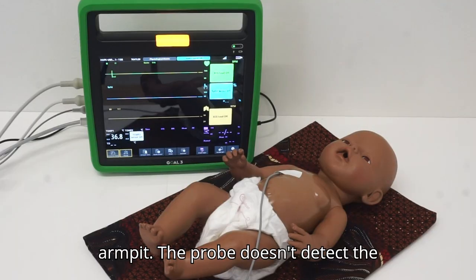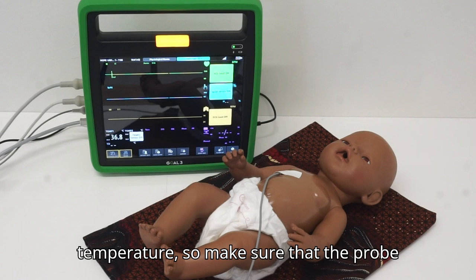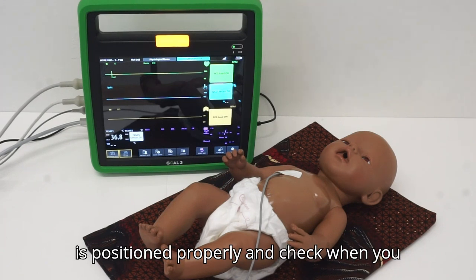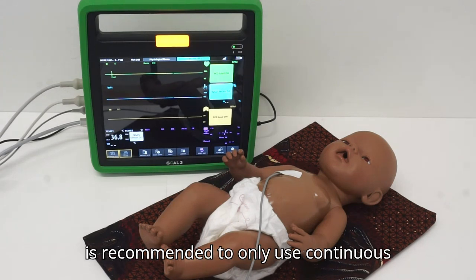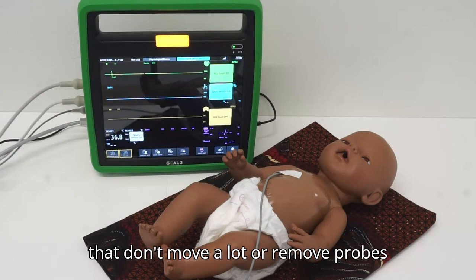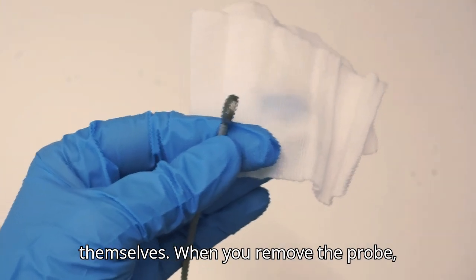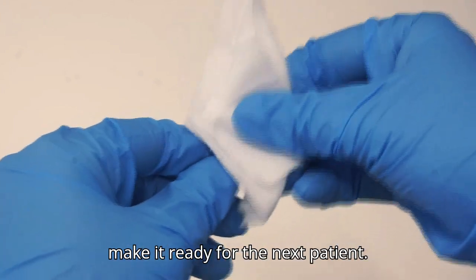The probe doesn't detect the difference between body and ambient temperature, so make sure that the probe is positioned properly and check when you don't think the reading is accurate. It is recommended to only use continuous monitoring of temperature on patients that don't move a lot or remove probes themselves. When you remove the probe, make sure to clean it with alcohol to make it ready for the next patient.